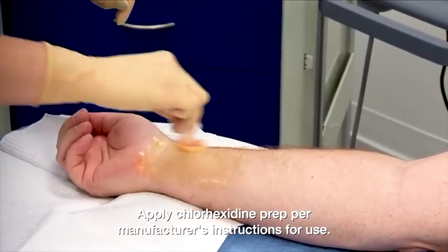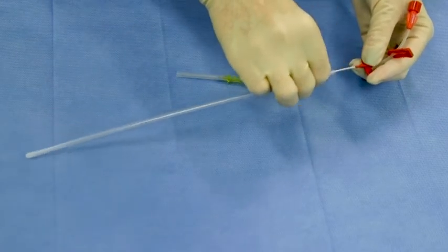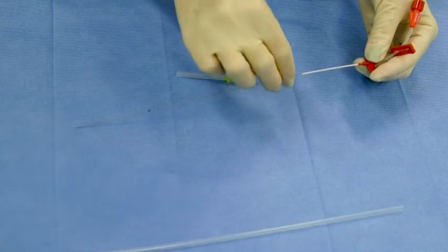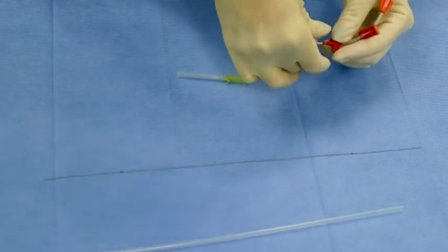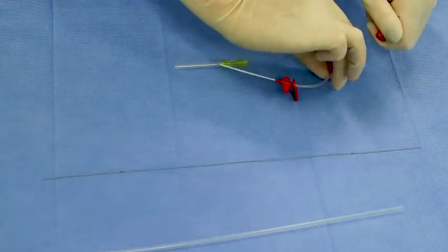Now we will review the catheter prior to insertion. Remove the protective shield from the catheter, then remove the wire and cap from extension tubing. Don a sterile probe cover using sterile technique. Once covered, the probe needs to be maintained on a sterile field.